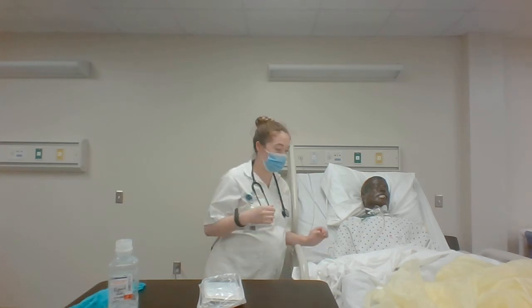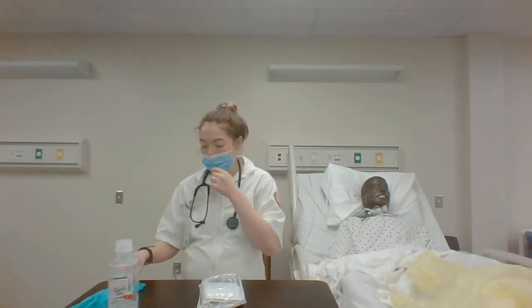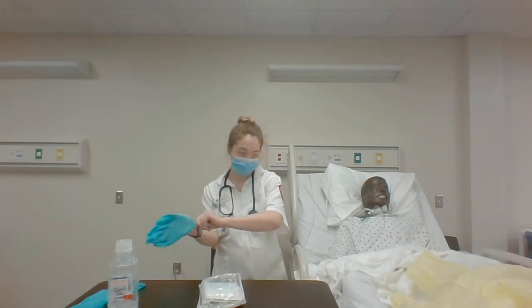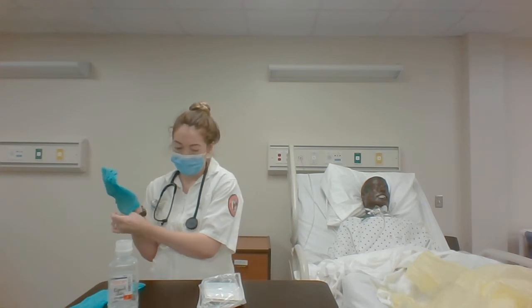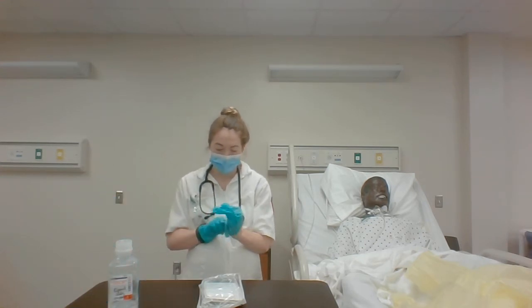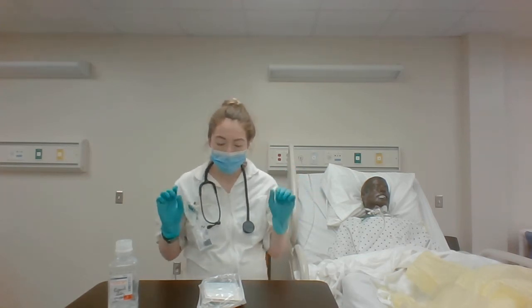I would don my PPE: first I would put on my gown, then my mask, then my face shield. Then I would wash my hands and put on clean gloves.